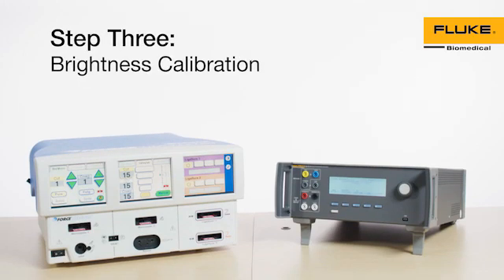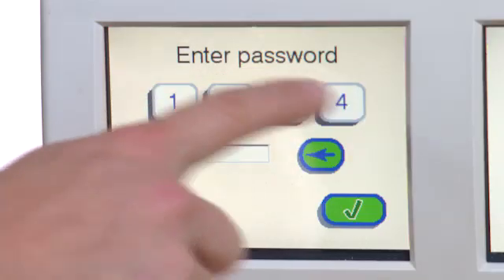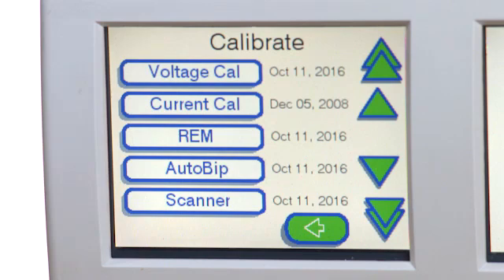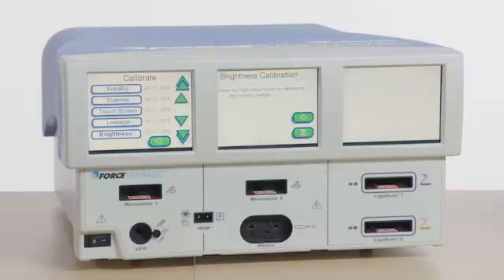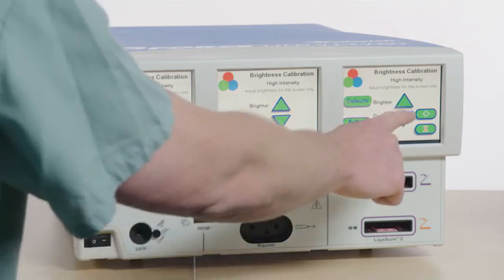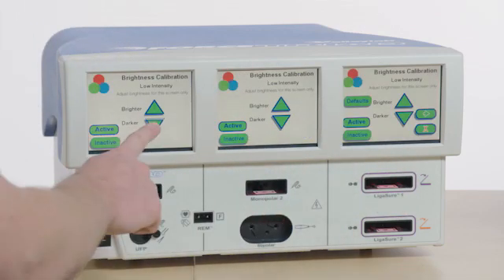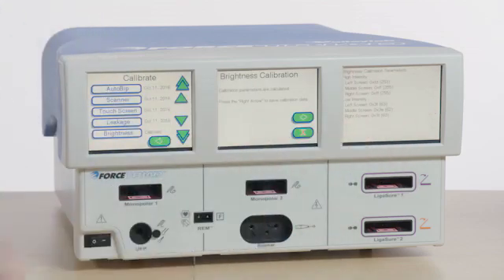Step 3: Brightness Calibration. Select the Service button. Enter the password as provided in the Manufacturer Service Manual and select Enter. Select Maintenance and then choose Calibrate. Scroll through the Calibrate menu list and select Brightness. Click Next. Complete the on-screen calibration instructions for each of the three touchscreens for high and low intensity settings. Select the arrow button, then select Calibration to save calibration data.